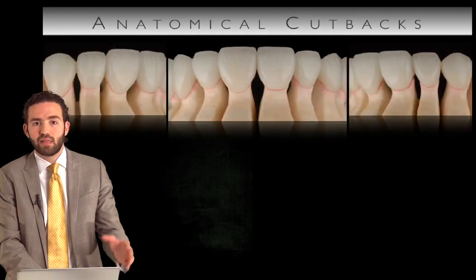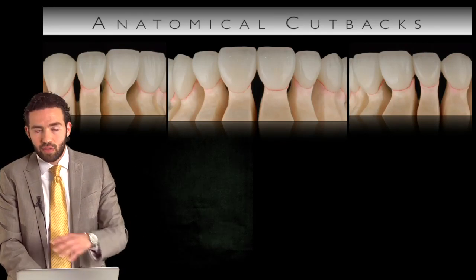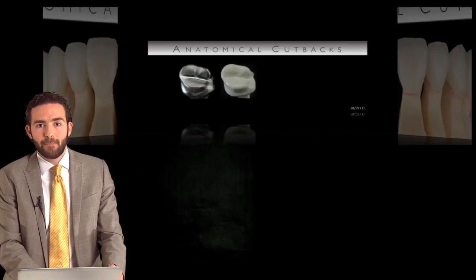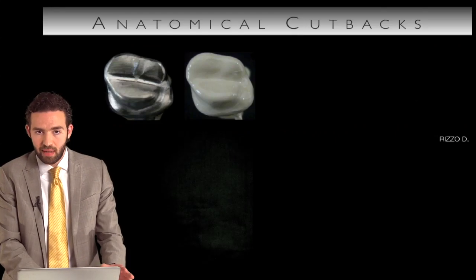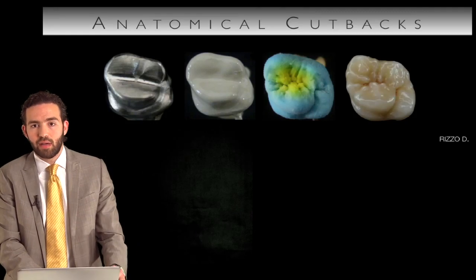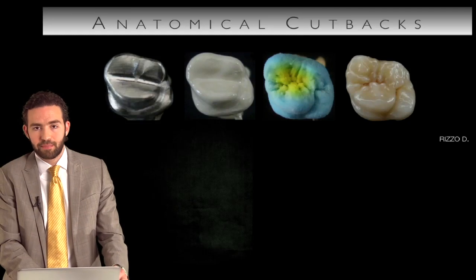In this instance, it's an actual case where we used full restorations made out of zirconia based. Again, the same as we learned in porcelain fused to metal, anatomical cutbacks, the same way as in we can get beautiful results with porcelain fused to metal, the same way we can apply it to zirconia.